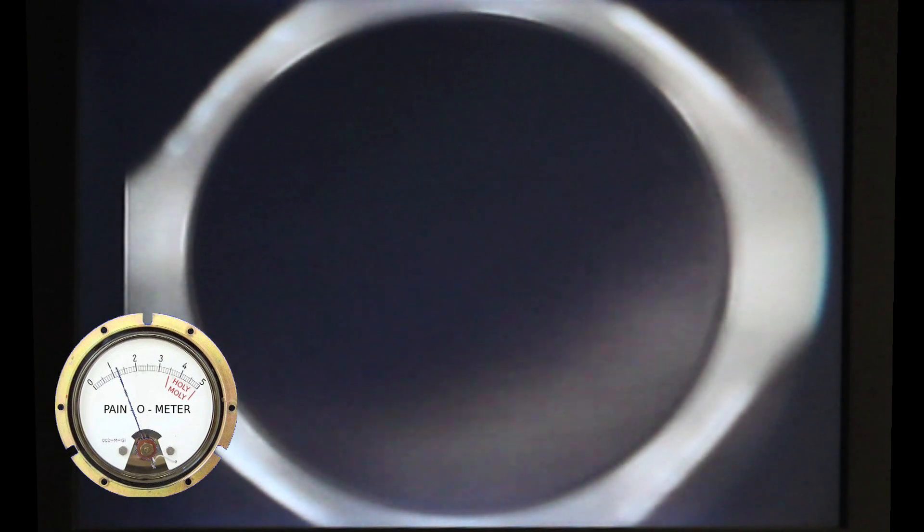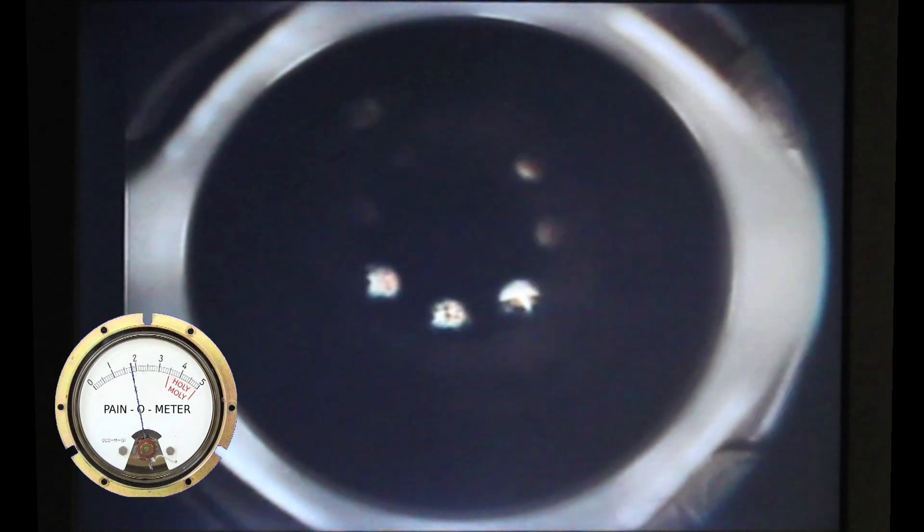And then, then this happens. They clamp you down and they put a little force on your eye, holding it still. So they get you zeroed in here and they mate the surface together, the clamp 3000 with this dumuflautcher, whatever this is. And then they put some downward force so that your eye doesn't move. And this is most certainly the only, I would say, painful part of the process. And it's not super painful.